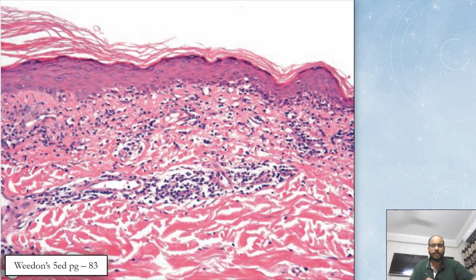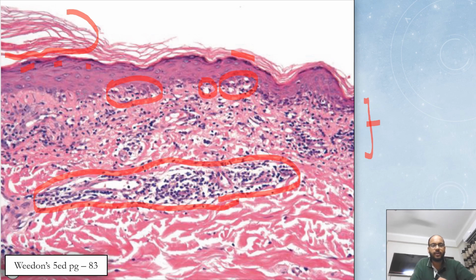So in this subacute lupus erythematosus, you can see parakeratosis. Look at this. This focus has a bit of parakeratosis. You can see granulosis. You can see the perivascular lymphocytic infiltrate here. You can see now that the vacuolization is very prominent. Look here, look here, look here. Okay, you can see that the basal cell vacuolization is now more prominent as compared to DLE. The mucin or empty spaces is milder as compared to DLE.